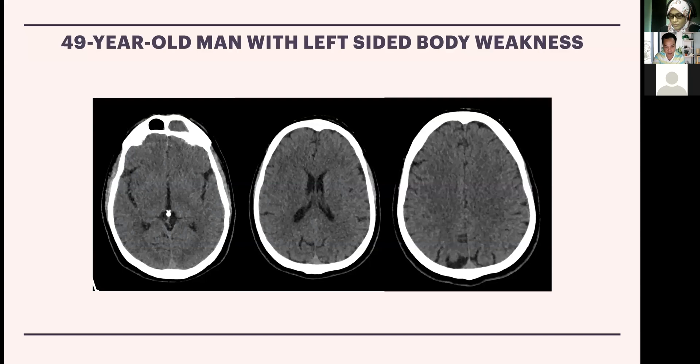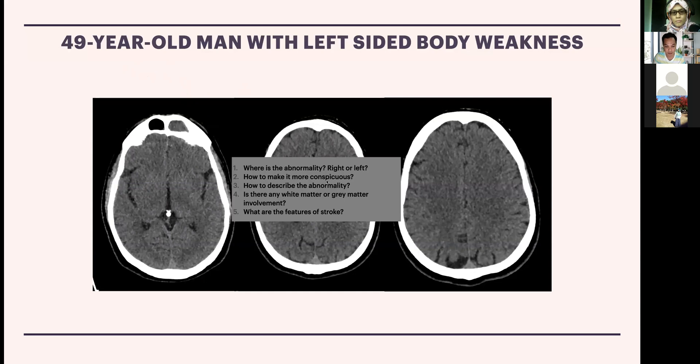Before going to anatomy, I want to show a plain CT brain in axial section. This 49-year-old patient presented with left-sided body weakness, and we can actually see stroke changes on this scan — very subtle. The questions that arise are: where is the abnormality, is it right or left, how do we make it more conspicuous, is there gray or white matter involvement, and what are the features of stroke here? Hopefully by the end of this presentation we can answer all these questions.